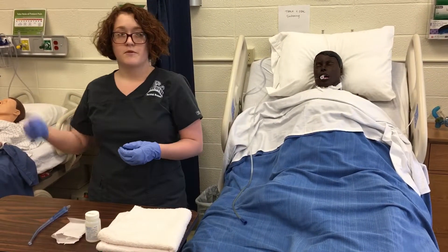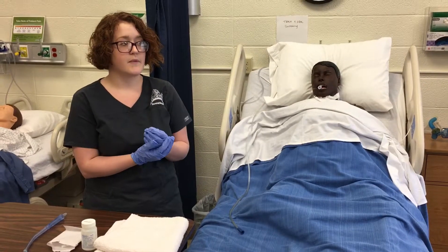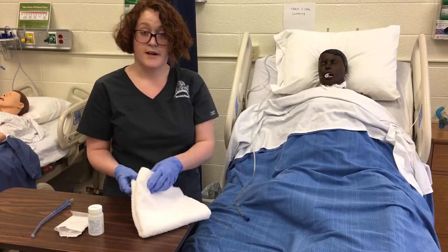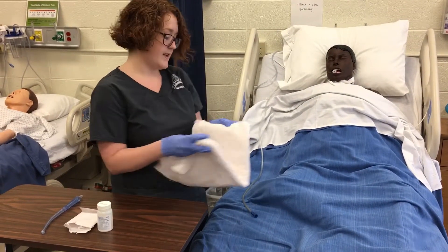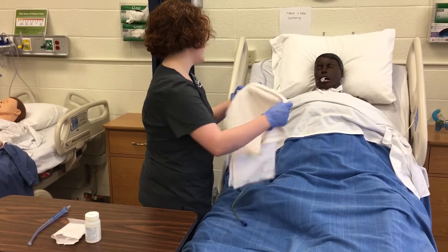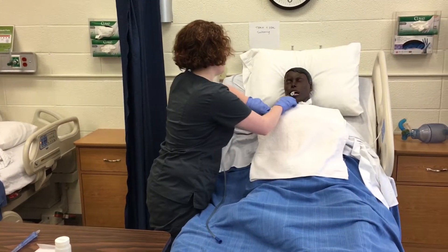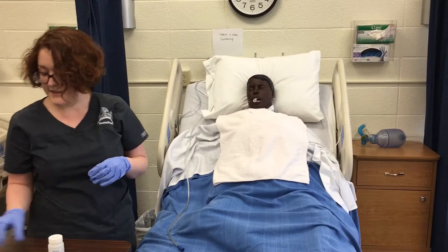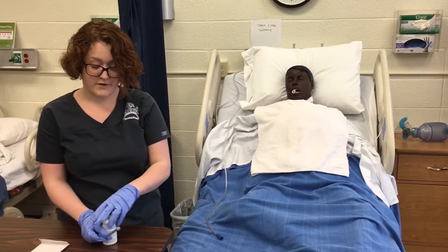I'm going to provide privacy. I will perform hand hygiene and get a new pair of gloves at this point. Now that I know that everything is functioning and working, I'm going to begin suctioning. I place a towel up here, and then I'm going to begin with oral suctioning first.